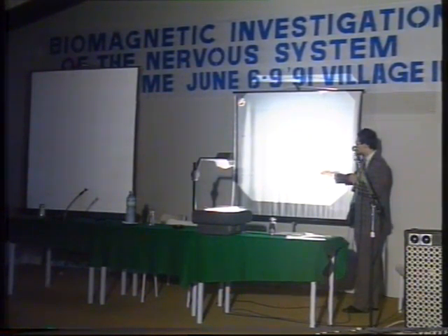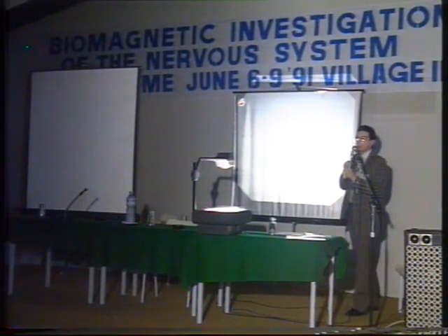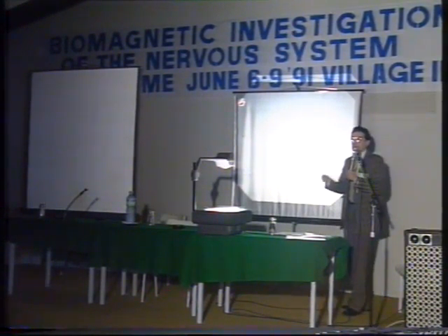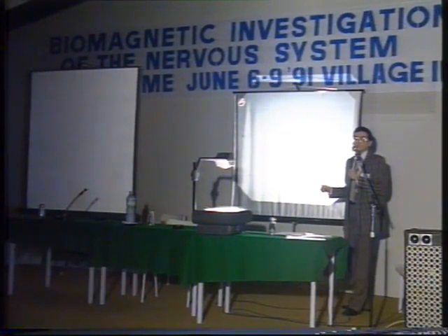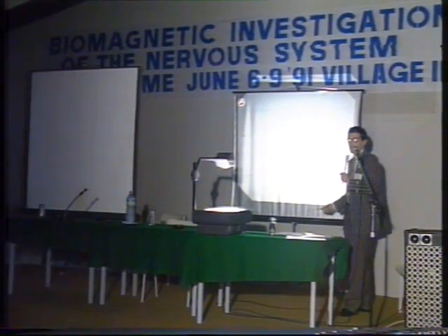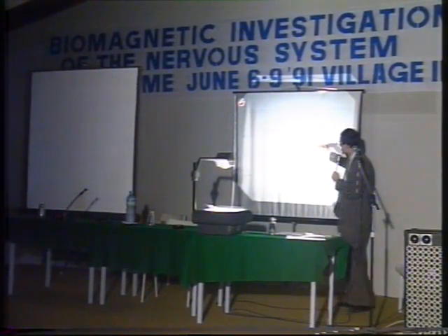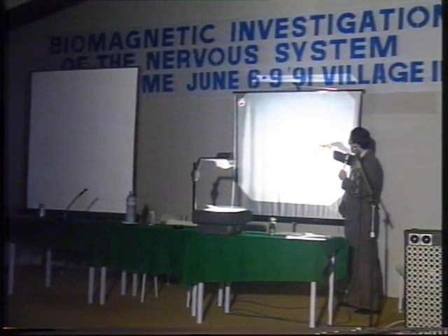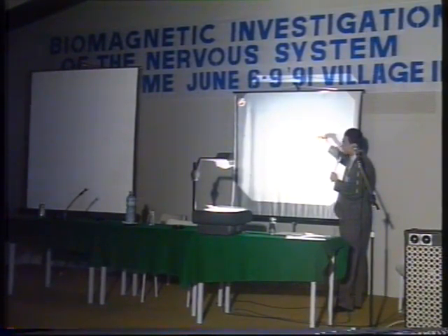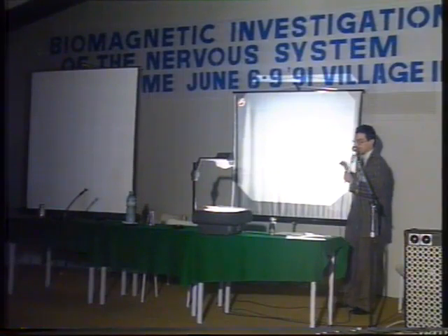In this case, it's a little bit after 20 because this is an old subject. We were trying to also have old subjects since we have to create a normative basis for investigating strokes. So usually we have old patients. And this is the N20 component, and I will focus only on this one. So I don't care about what comes next.